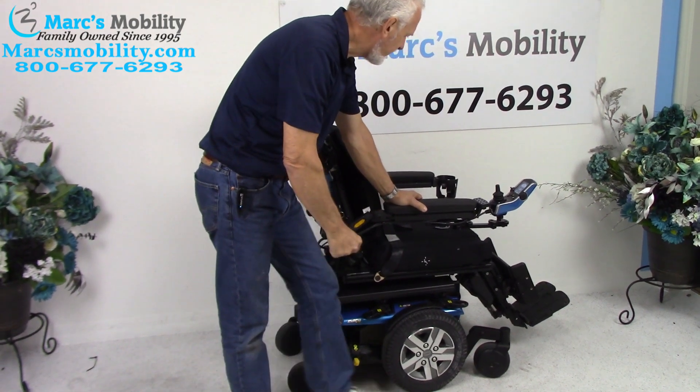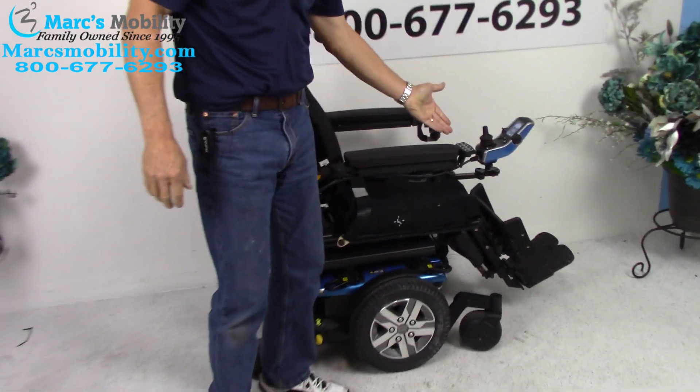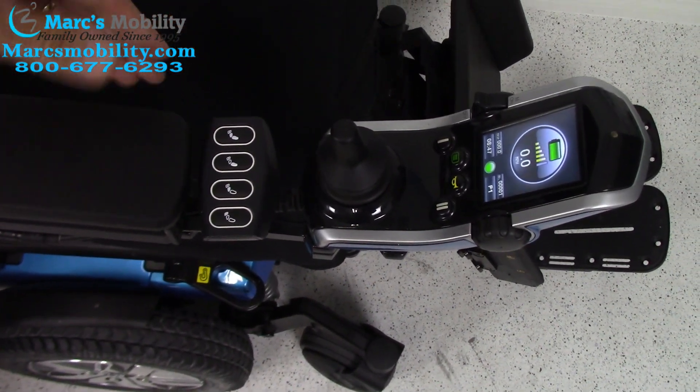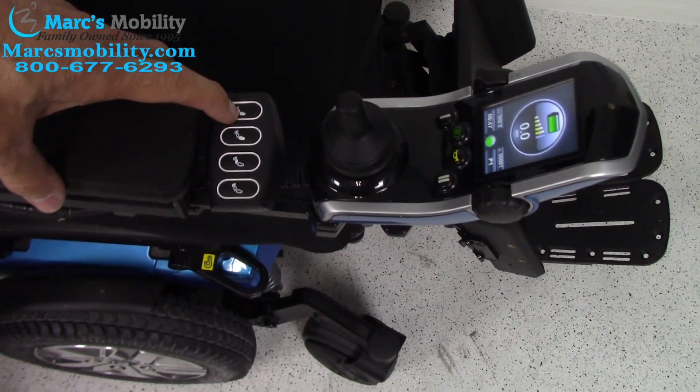All the functions on this chair have to be worked through the joystick — either through the joystick or through the switch box. I like to use the switch box. So the first thing we're going to do is the electric tilt. The first button would be the tilt.